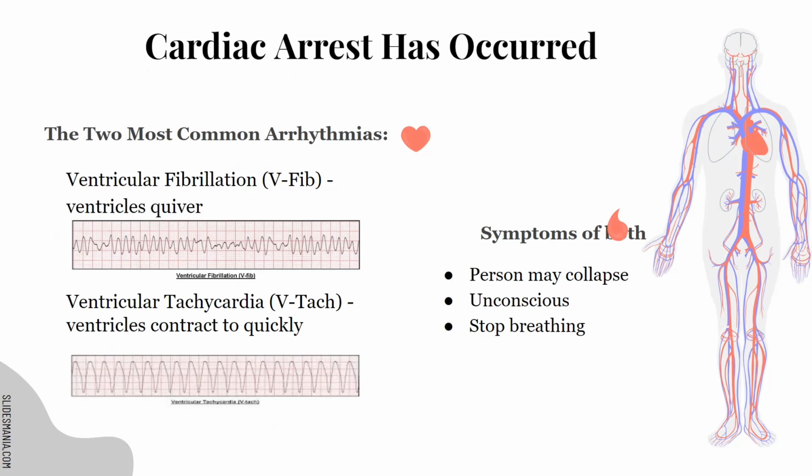The next one, at the bottom located here, is what we call in the pre-hospital and hospital setting VTAC. This is ventricular tachycardia. Now, both of these have the word ventricular, which talks about the ventricles, the lower sections of the heart. Now, tachycardia: the word cardia means heart, tachy means fast. So they're talking about the ventricles of the heart moving fast, which is called VTAC.